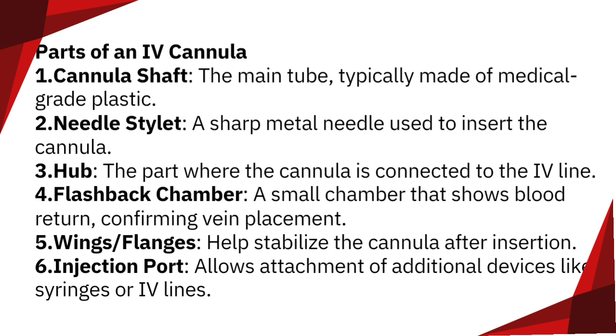Flashback chamber. A small chamber that shows blood return, confirming vein placement. Wings or flanges. Help stabilize the cannula after insertion. Injection port. Allows attachment of additional devices like syringes or IV lines.